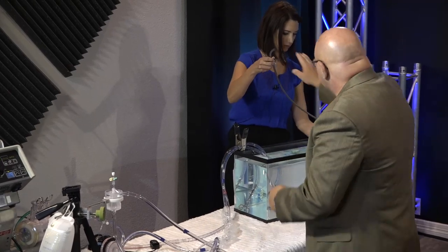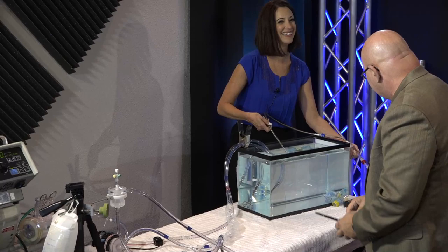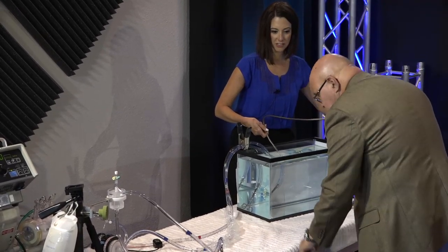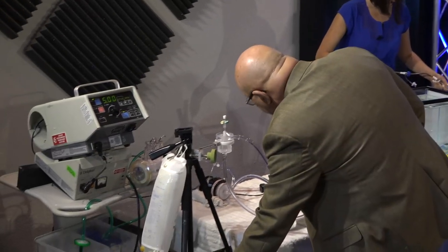And it's under pressure, so it's gonna squirt. On. And there you go. And we'll tap the line a little bit. I'm actually shocked how fast and easy. And there, that's primed. And we're happy.